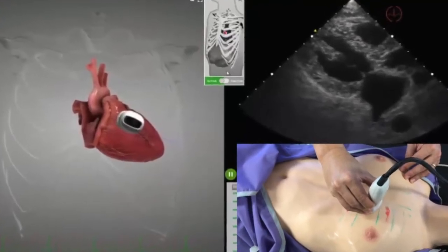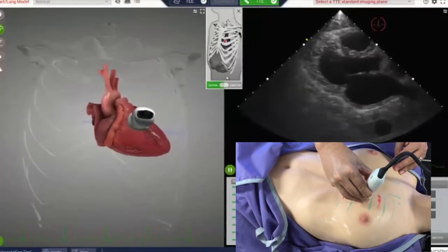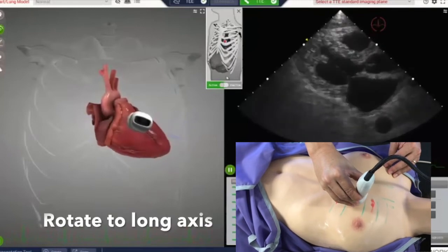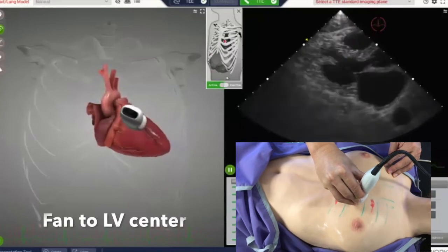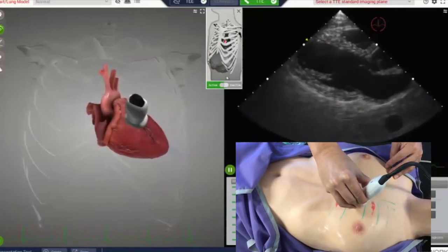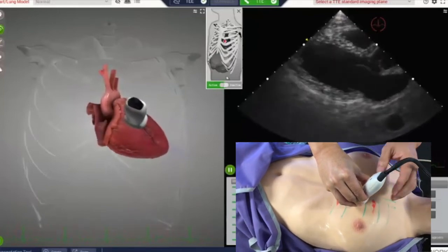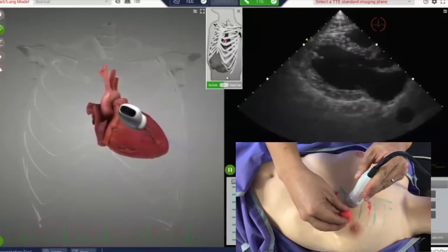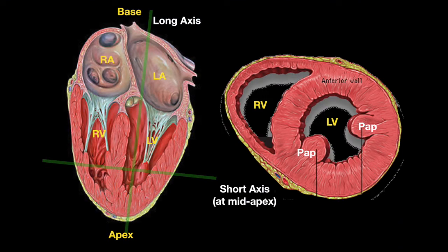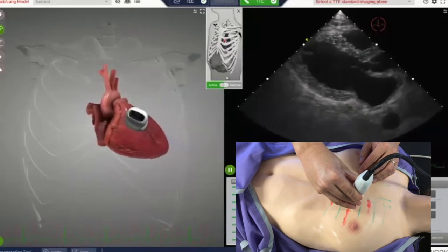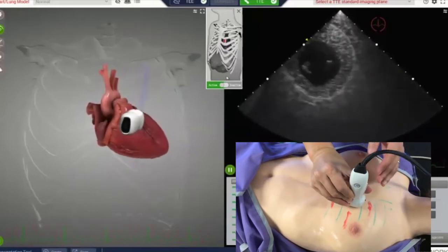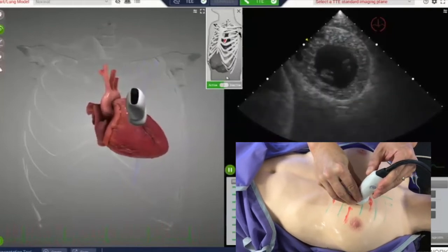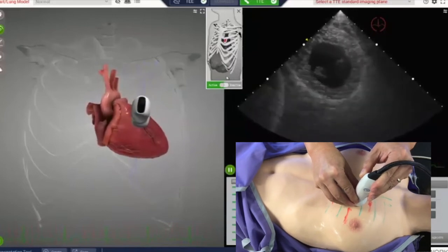Now let's put all these optimizing techniques together — you can adjust the order according to need. First, angle towards the apex and slide medially to get a more horizontal LV. Second, rotate to find the long axis. Next, fan or tilt to find the LV center. Finally, visualize the long axis. Learn to visualize it in your mind because this is really important for the next windows. Once you know the long axis, rotate the probe clockwise 90 degrees to arrive at a parasternal short axis. If the LV appears off center, angle in the same direction to center it, and then slide along that imaginary line to image from base to apex.